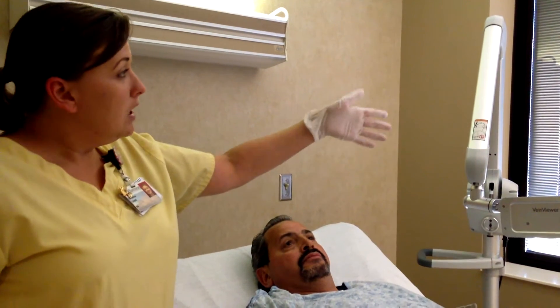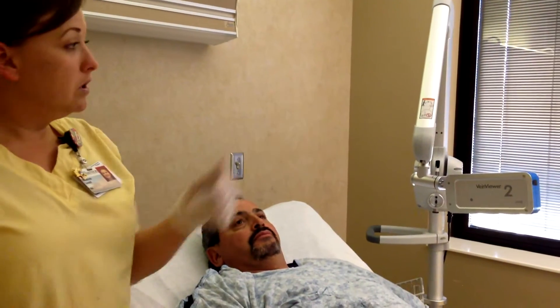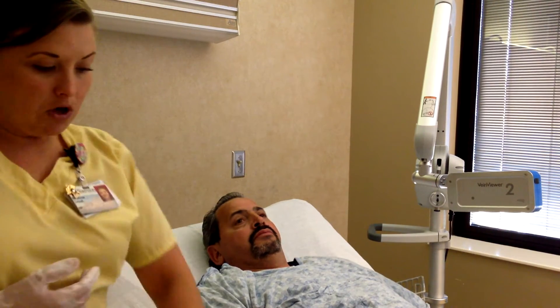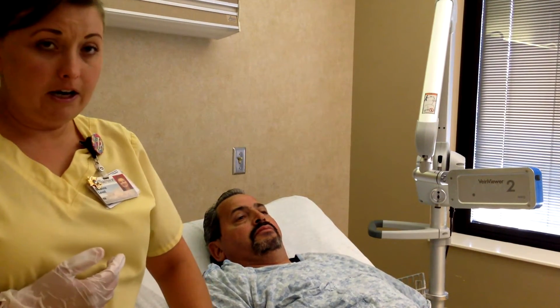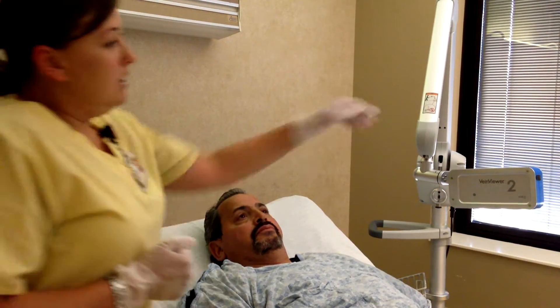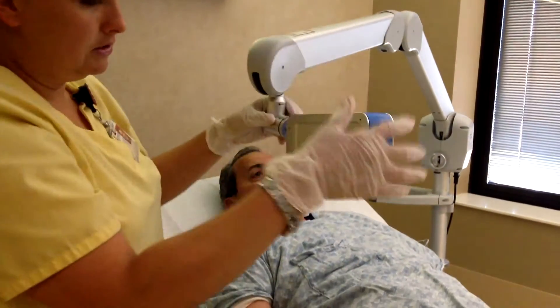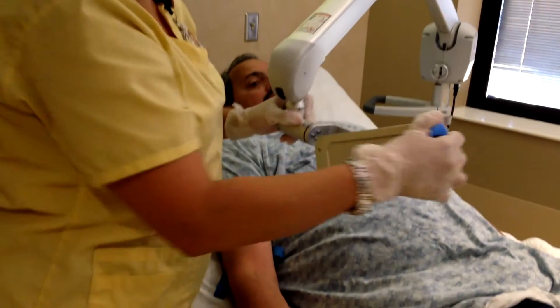I'm going to demonstrate the Vein Viewer Vision 2, which helps find veins. Right now I'm just going to show how it moves about. If it were placed on this side and I were wanting to try an IV on his right side, I could just take it and move it like this. And this moves very easily as well.